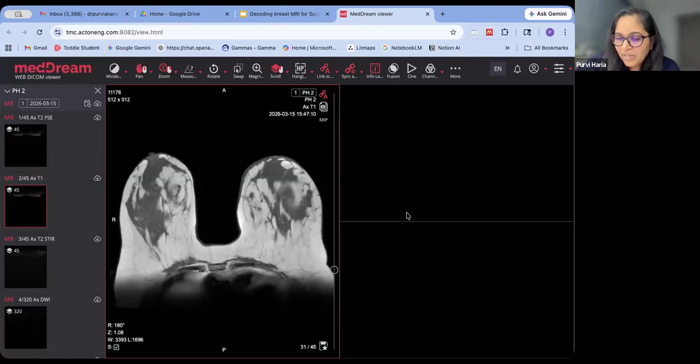But with ultrasound elastography after 2 cycles of NACT, we are able to predict the final PCR or significant response or no response. But I don't have experience with MR elastography on that. There were some sequences which were going to come to our institution for doing that, but it has not come. So I'm sorry, I cannot answer that question.